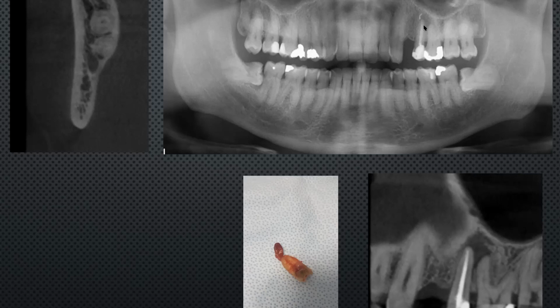Yeah. And so I would say do some guided and then maybe do a couple non-guided, or even, if you're game, have a guide, do it freehand, but then just compare it. I don't know, but you've got to push yourself to progress, because one day you'll have a guide and for some reason something will go wrong and it won't work. And then you will have to improvise. And that's happened to me as well. You just have to make do with what you've got.